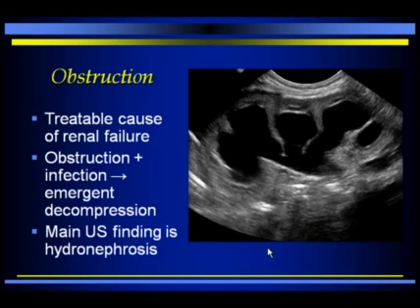Moving now to perhaps the most common cause or reason for renal ultrasound, renal obstruction. The reason this is such a common indication is because ultrasound is a great way to evaluate for obstruction, and this is the number one treatable cause of renal failure.